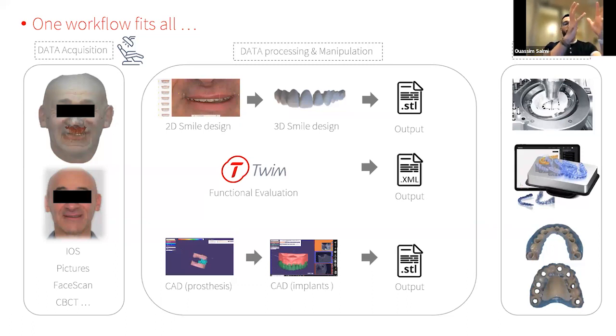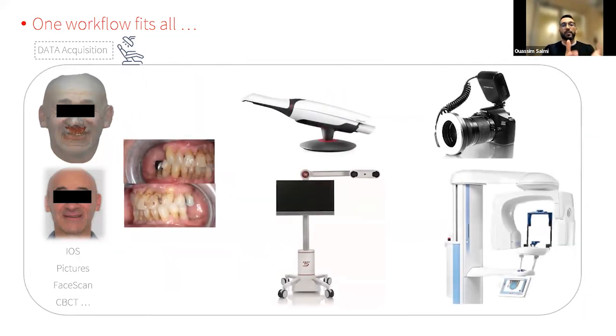So acquire the data or recording the data is data acquisition. Working with the virtual data is data processing manipulation. From the data processing manipulation, you will get STLs and everything, and you are going to produce those, like an execution step. So here, if we talk about data acquisition, use whatever tools you want, okay?